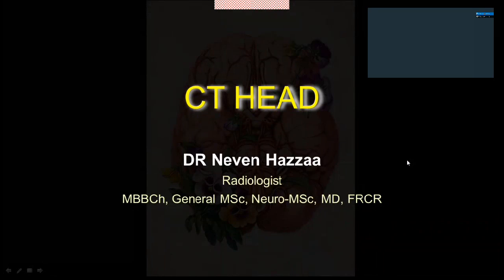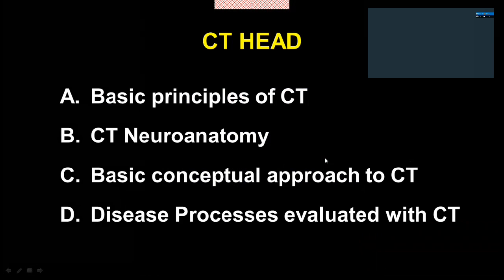This talk is intended to serve as a good introduction to a CT head. To start off, we will briefly review some key concepts and discuss the basic principles of CT. We will also learn some basic relevant neuroanatomy, and we will introduce a basic conceptual approach to the CT scan. At the end, we will go through multiple cases.